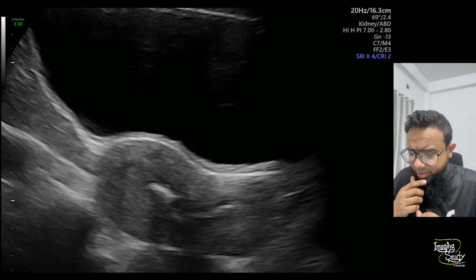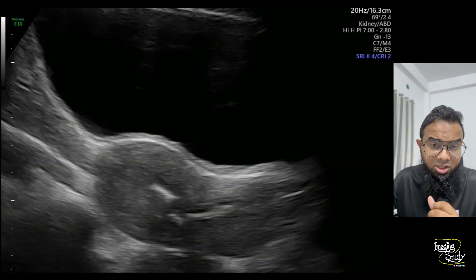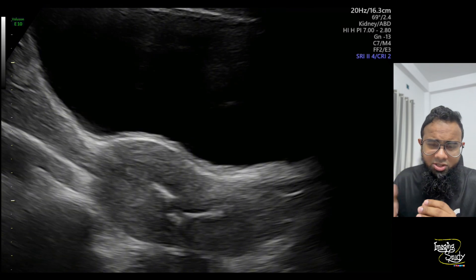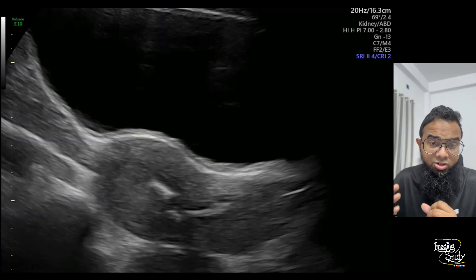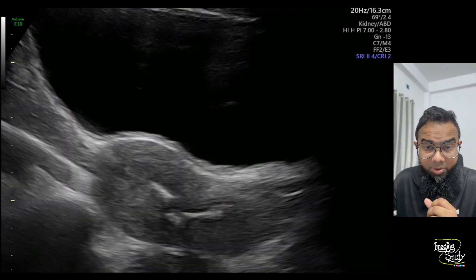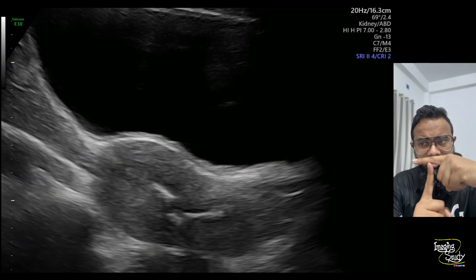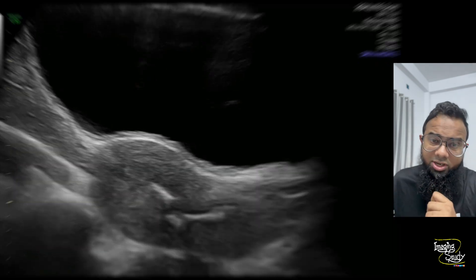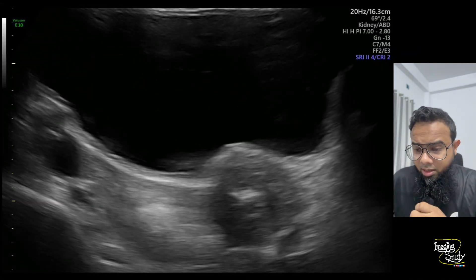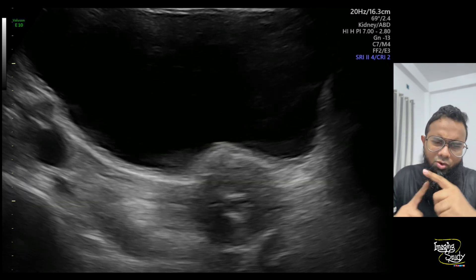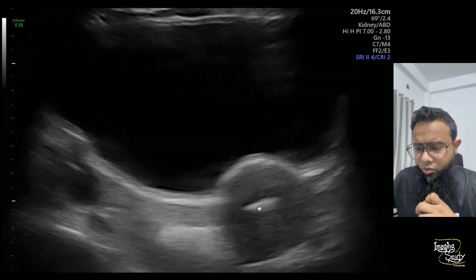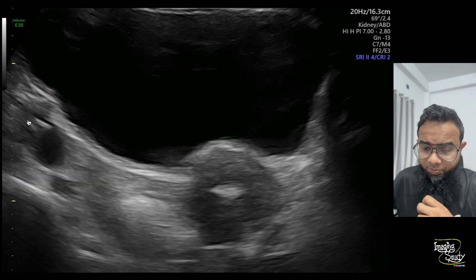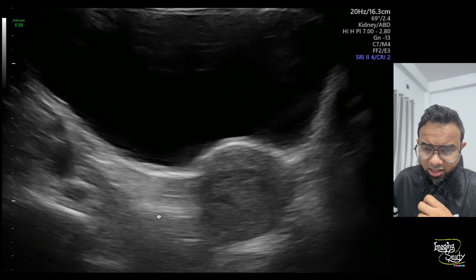This may also be misdiagnosed as an intrauterine contraceptive device. You can easily differentiate: just place the transducer transversely. If it is an IUD — especially a copper T — you'll see the T-shape pattern, and the horizontal part will be easily identifiable on the transverse section. On this transverse section, there is no horizontal part, confirming these are calcific areas within the endometrium.